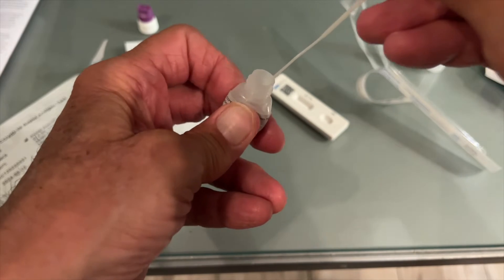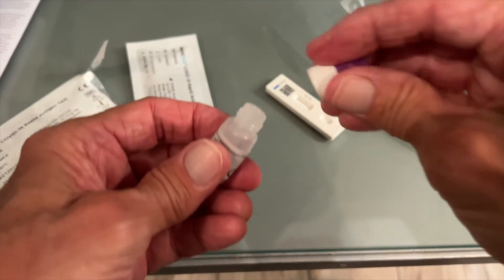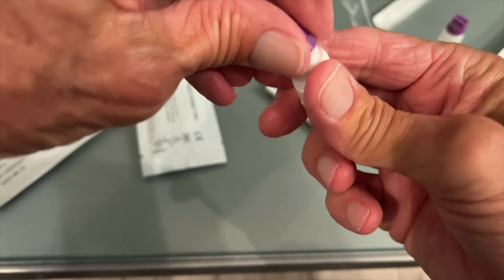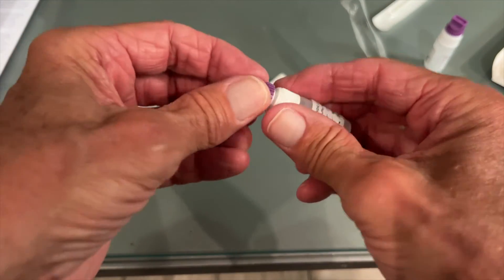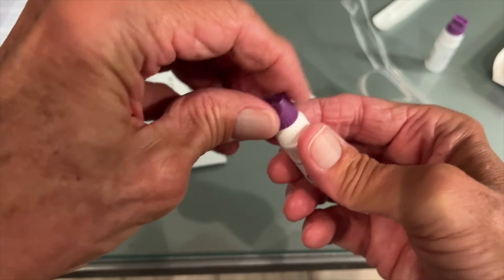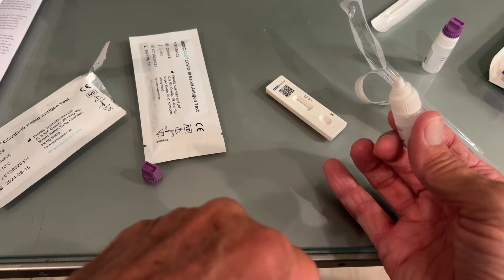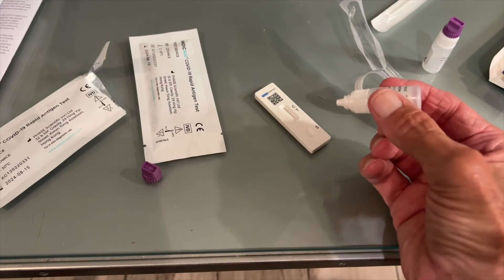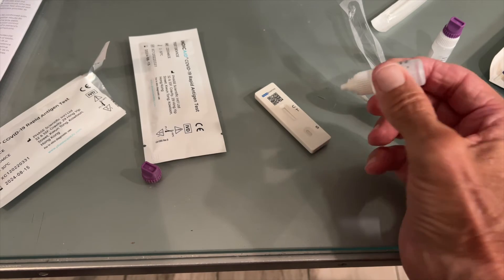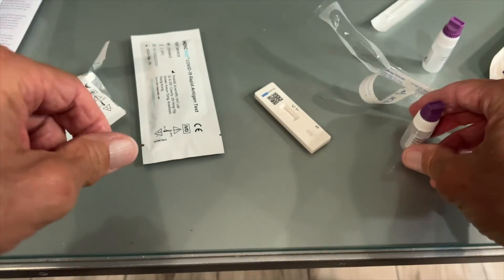All right, I'm going to set the swab over here. Now I'm putting my top back on just like that. Then you unscrew the purple part and make sure you tighten it down. Now we're going to put in three drops — here we go: one, two, three. It really came out. I don't know about that, but all right.